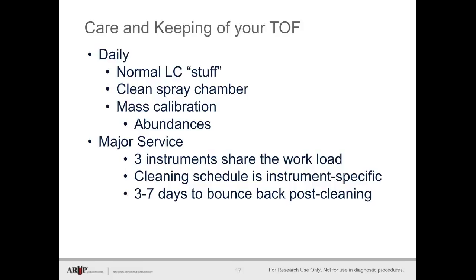Major service, like a front-end cleaning, will depend on what and how much you're running. We are a busy lab. Thousands of samples per month pass through these instruments. What we found is that every instrument has its own personality of sorts. Some can go longer than others without being cleaned. It usually takes 3 to 7 days for an instrument to come back to normal post-cleaning.